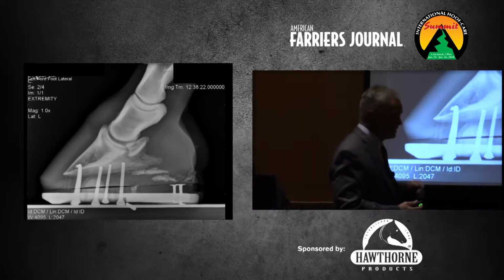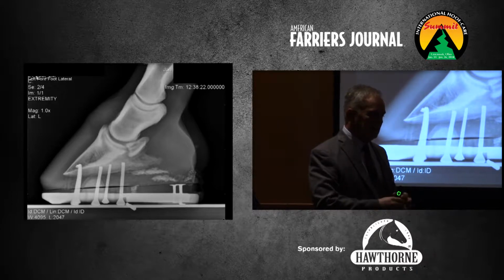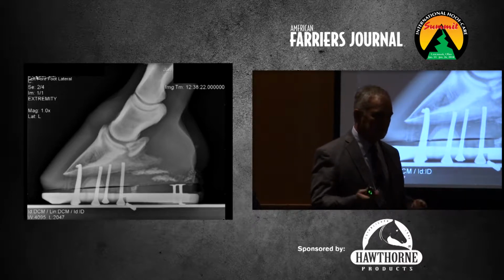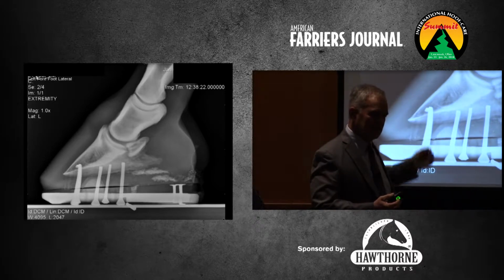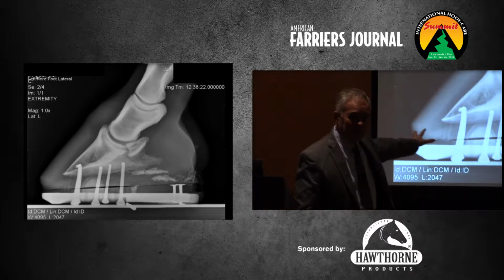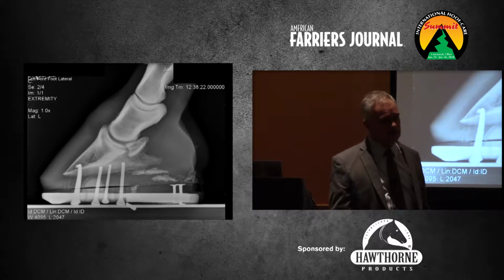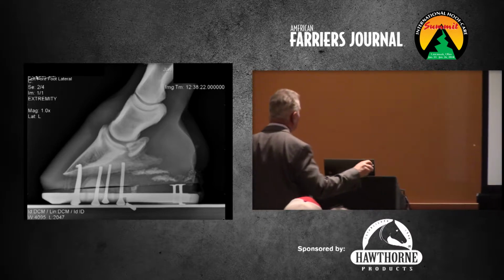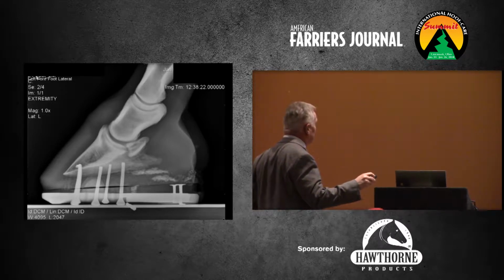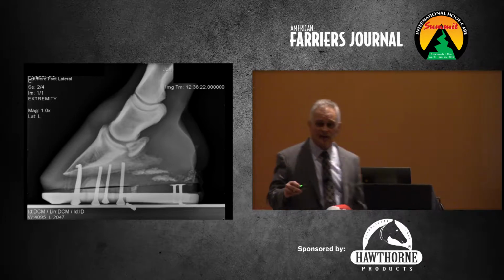So we chose a 3 degree, just to kind of go up that way, and we thought you might have got a little bit with the trim, Travis might have, and then went ahead and added the 3 degree and just see how we got. So again, this is giving he and I instant feedback. This is right after shoeing, and we're like, okay, yeah, I think pretty happy with that. Went from that, to that. And we'll see how that goes with that horse.